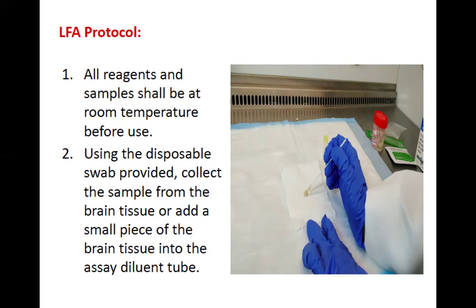We have the sputum samples or the saliva samples, but we do not know which part in the vials is highly concentrated with the target antigen that we wish to have. So after some time we came up with new protocols to get the most antigen from the sputum samples. So you have to do that with your own samples.